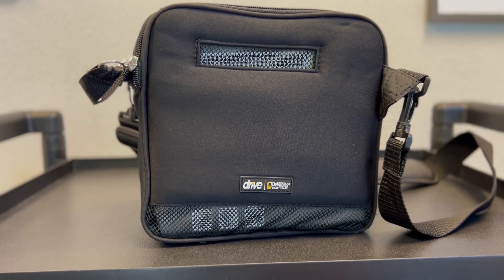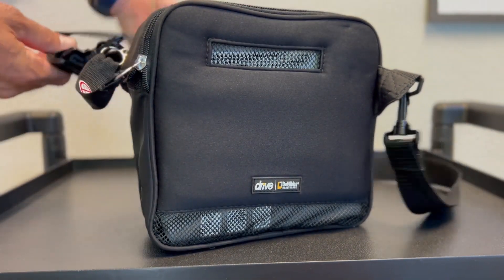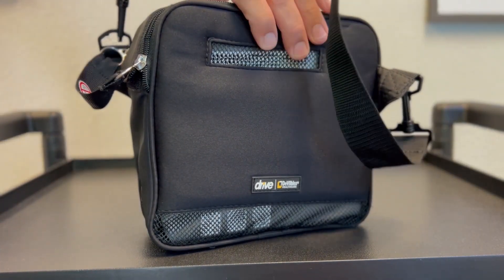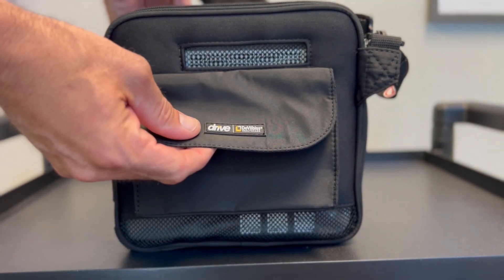The Drive DeVilbiss iGo 2 comes with a cushion carry case, a shoulder strap to make it easy to carry, and an accessory pouch to store your power cords.